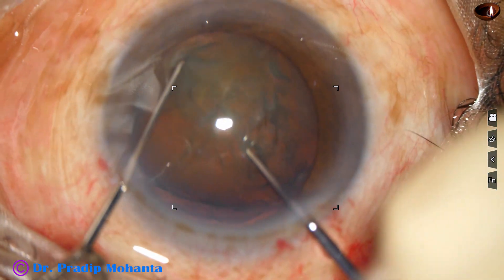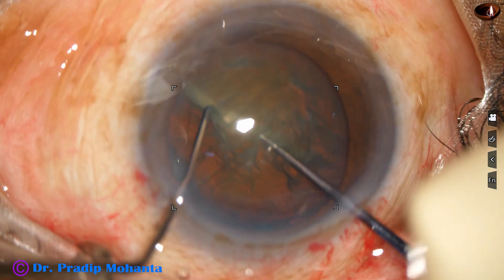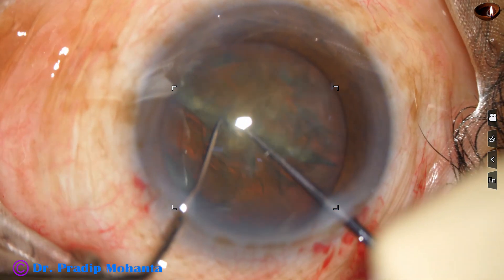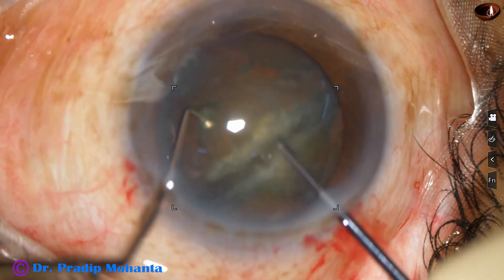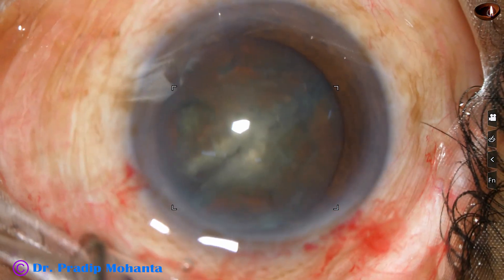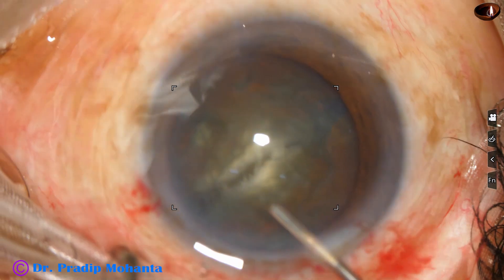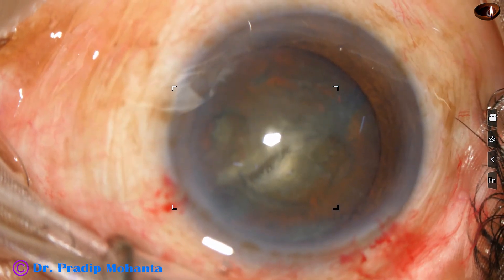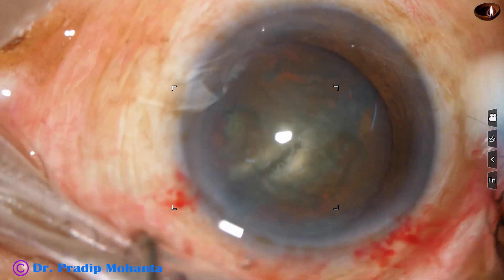Now I am trying to pre-chop this nucleus — see what happens. The pre-chopper is going at the same depth as in other soft cataracts, but I could not divide the nucleus into two hemi nuclei. There is a dense posterior plate that did not allow the hemi nuclei to be separated completely.